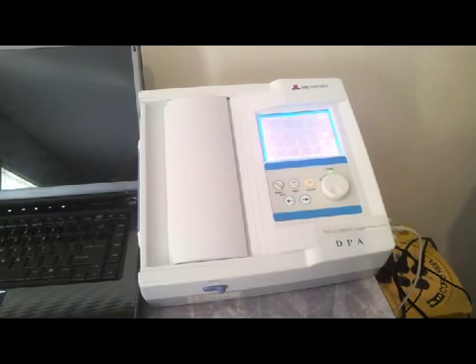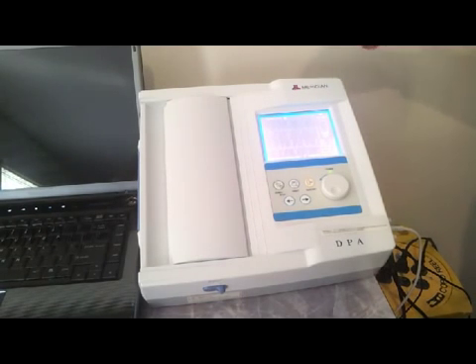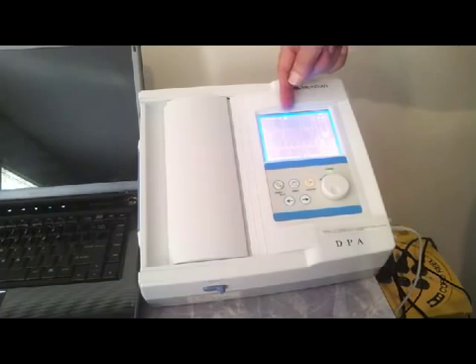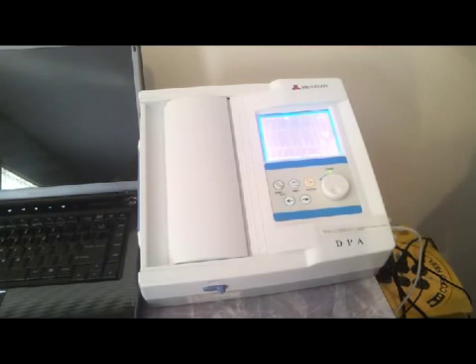Now it's measuring. As soon as it's done here with the one minute, you can see the progress as it goes across a few bars in progress.